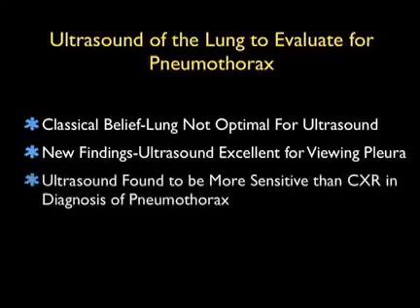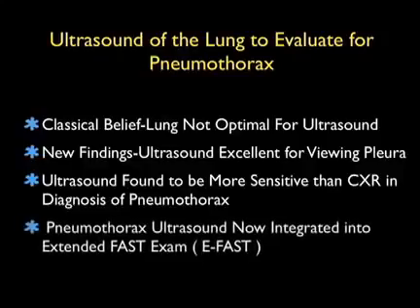There's been a lot of research looking at this, and what's interesting is that ultrasound has now been found to be more sensitive than chest x-ray in the diagnosis of pneumothorax, especially in the supine trauma patient. And now we're going to add views of the lungs looking for pneumothorax as part of our extended FAST exam, or the eFAST exam, that we'll be performing in trauma patients. We can also detect pneumothoraces in our medical patients.